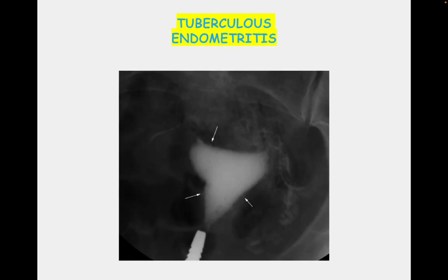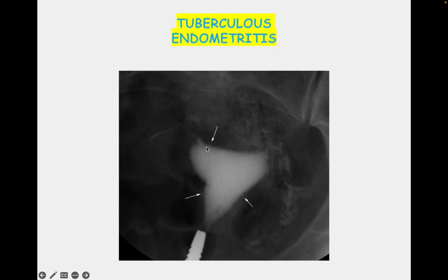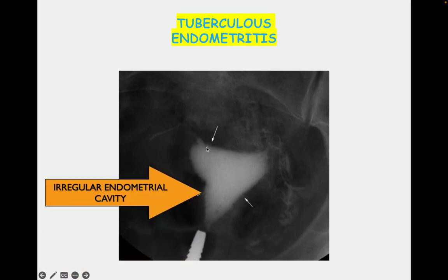Now we discuss the fallopian tube images and move to endometritis. The endometrium also gets involved, as already mentioned, in 50 to 80% of cases. The endometrium can be involved in tuberculosis, although the fallopian tube is the most common site. Here you can see the irregular endometrial cavity, which is suggestive of endometritis.